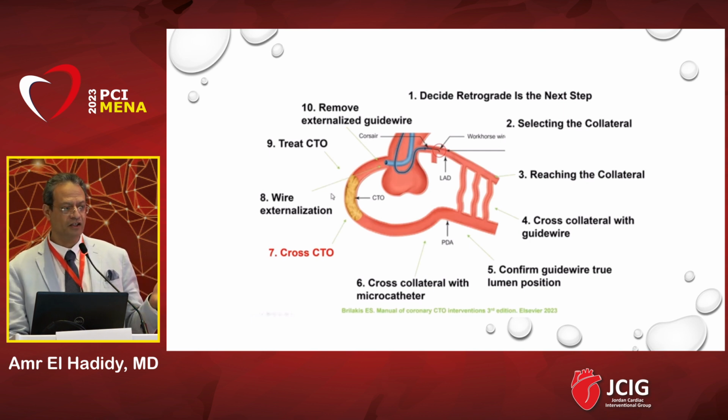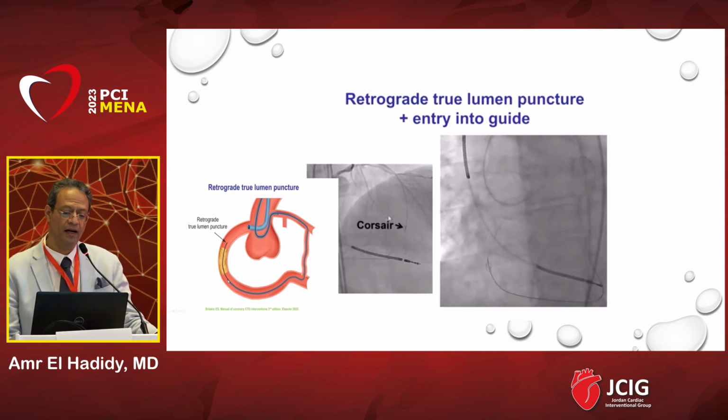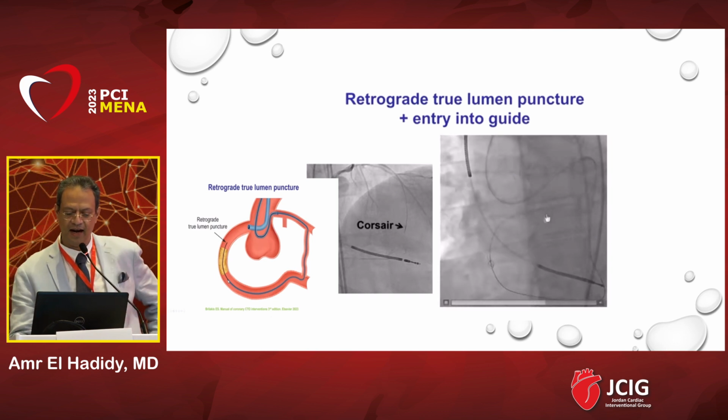You can use, as we mentioned, the retrograde wire just as a marker, and this is very important to see the directed antegrade wire in front of this retrograde wire. So one of the important points is how to enter with the retrograde wire into the antegrade guide.